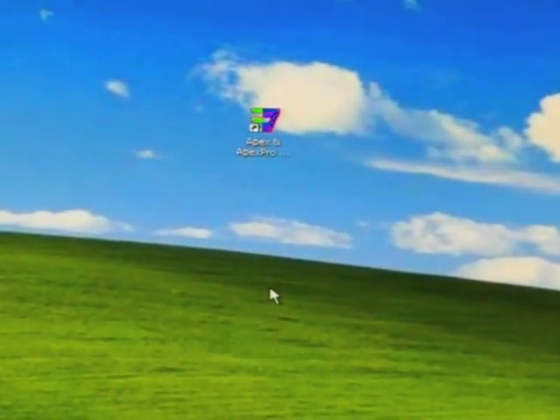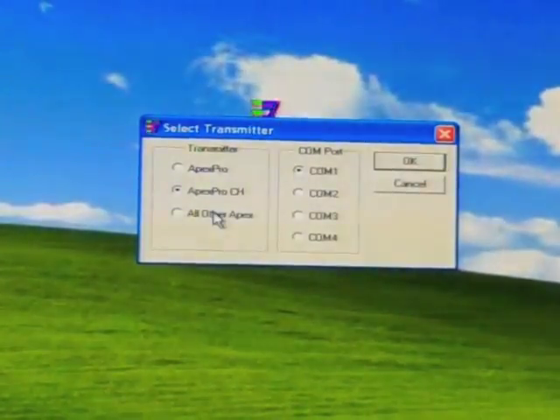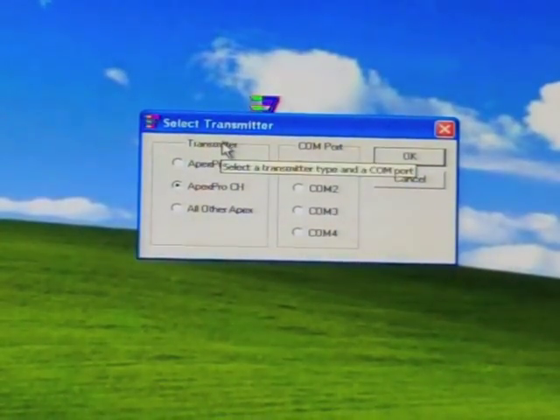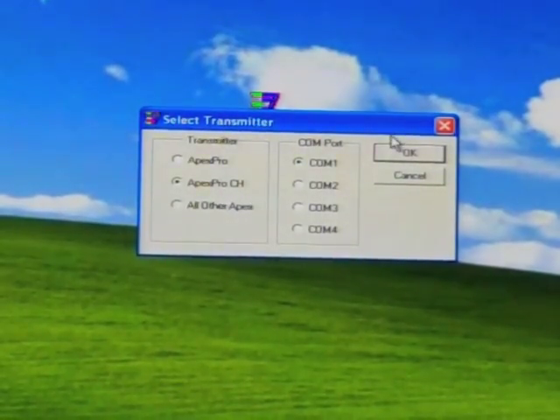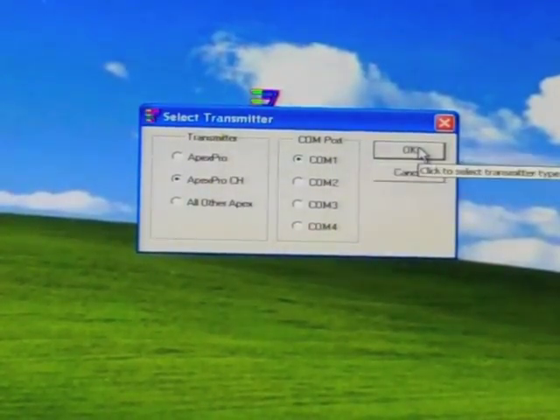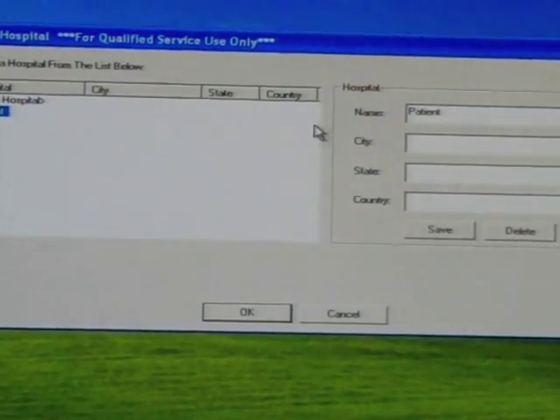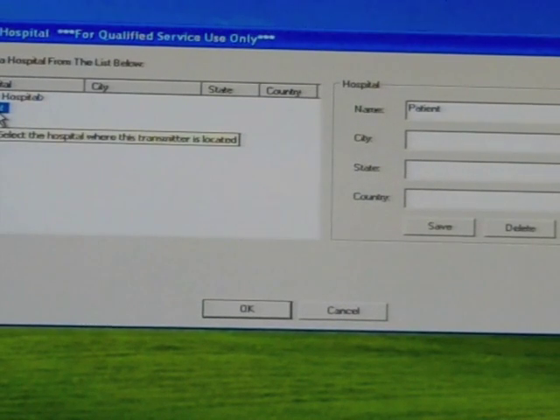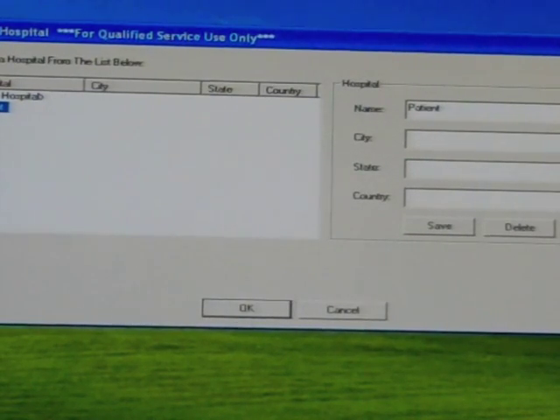After you've installed your programming device, an icon like this will appear on your screen. You should double-click that, select the appropriate transmitter that you're working on, which in this case is Apex Pro CH. COM port 1, that's where we have our tool plugged in with the serial cable. Hit OK. In this box, you will have to enter a patient name, even if it's a generic patient like ours, patient. Be sure it's entered and highlighted. Hit OK.